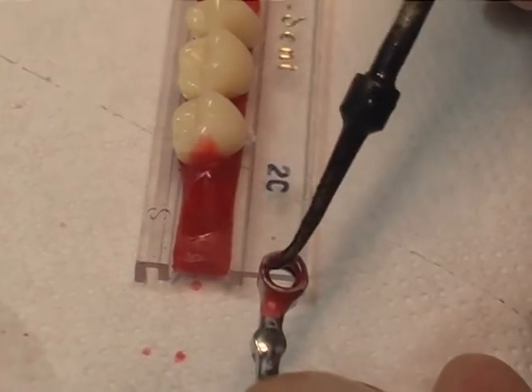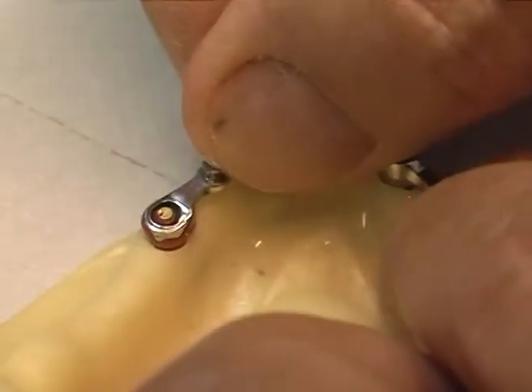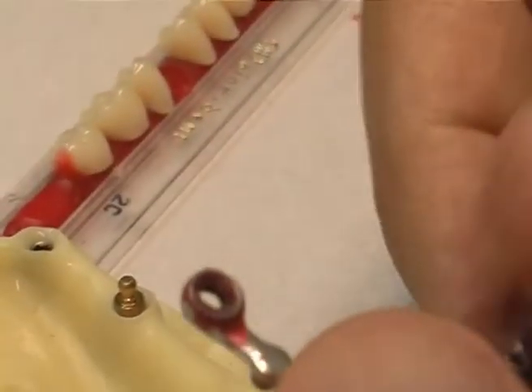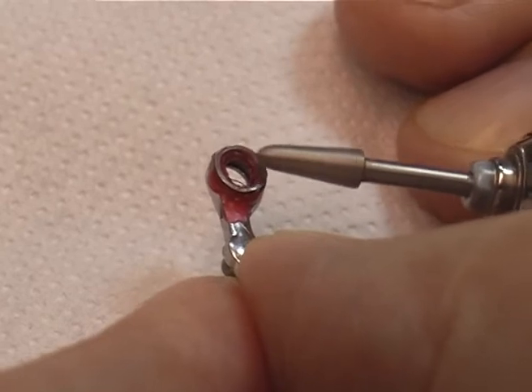Try the position of the annular blocks on the model, even using soft wax or silicone, in order to detect any wrong connection with understructures. Eliminate these connections where necessary with a burr.